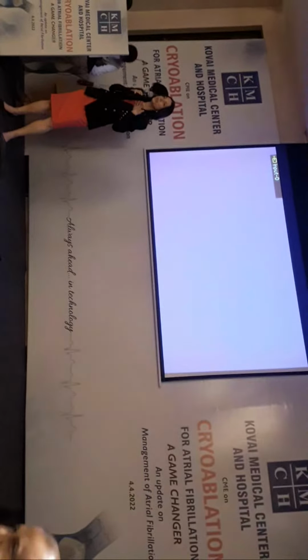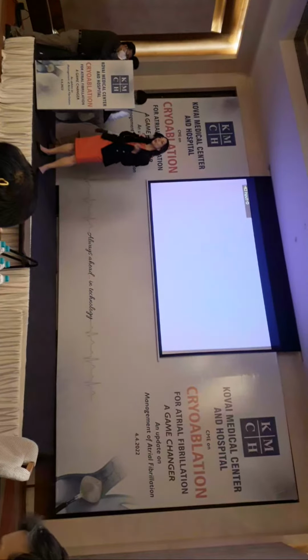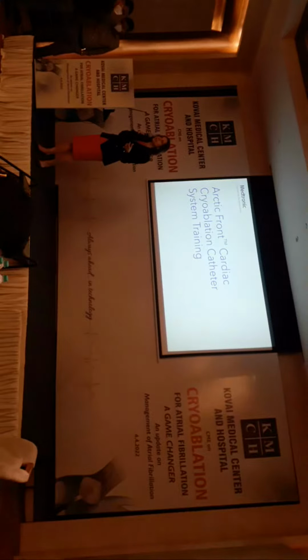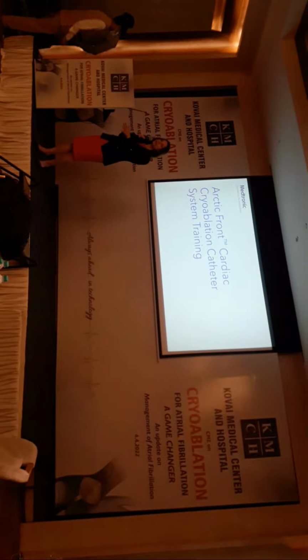And at that time at least, we provided our own sedation, meaning as the operator of the radiofrequency, you delivered your own sedation during the procedure. So it was like I'd be working until the patient expressed pain or started moving. Then I had to, with one hand, hold on to the ablation catheter, and with the other hand pull up some sedation and deliver it through one of the sheaths.